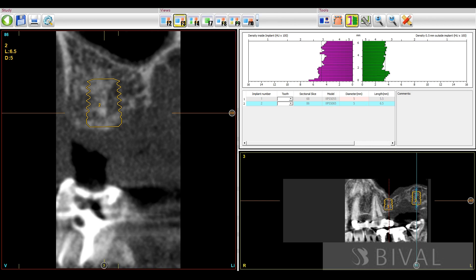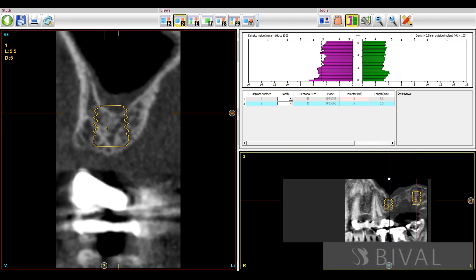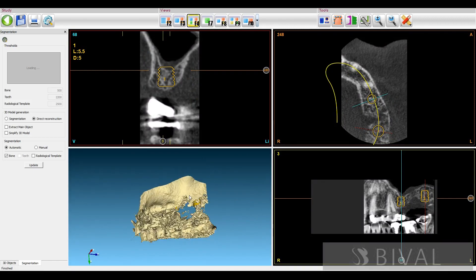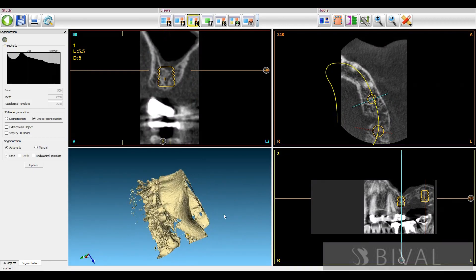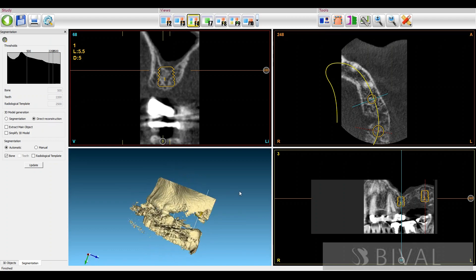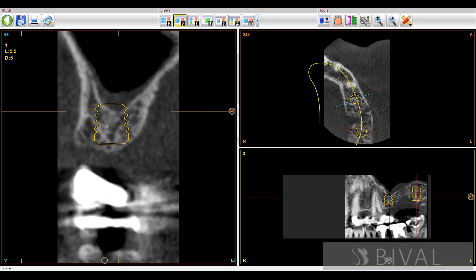Because of the lower bone density, which is under 400 Hounsfield units as you can see by the CBCT scan, the drilling protocol is going to be short and easy. After we drill the holes, we will put in PRGF and the RAT system to give you better bone healing and stability, and then suture the wound also using the PRGF and the RAT system.